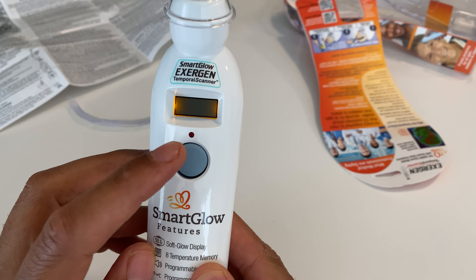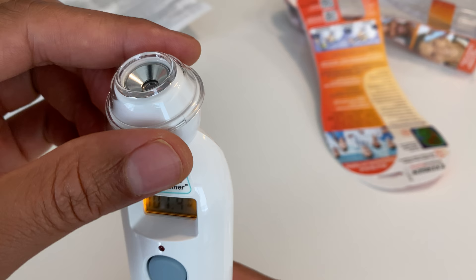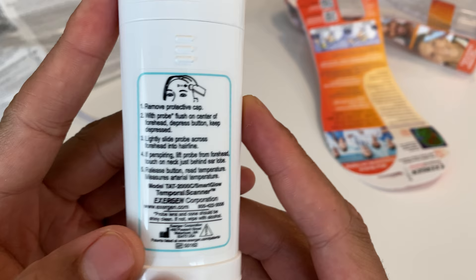Before reading the instructions, I flip it around and press the button to see what happens. It gives me a reading of 101 — I don't know where it's getting that from. I'm going to remove the cap like they instructed before doing a proper reading.